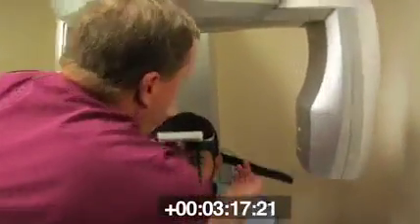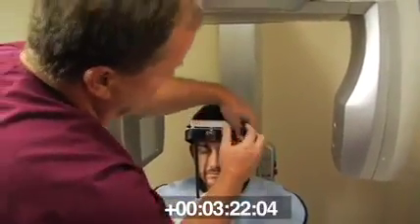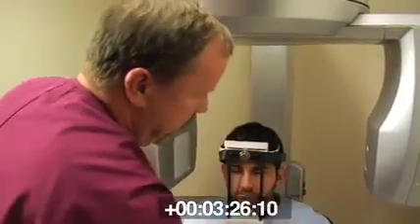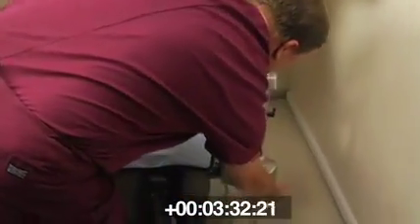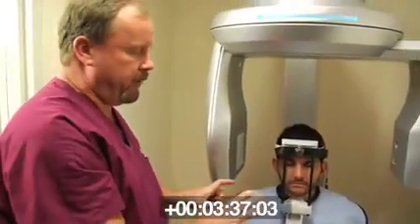We have a little strap we put around the head just for stability. And basically we keep this down low around the crown of the head. Put a little squeeze on it here. We'll tighten the arm. Make sure it doesn't move, and then we have a locking arm right down here that locks it in place. So now the patient's seated and ready to go.